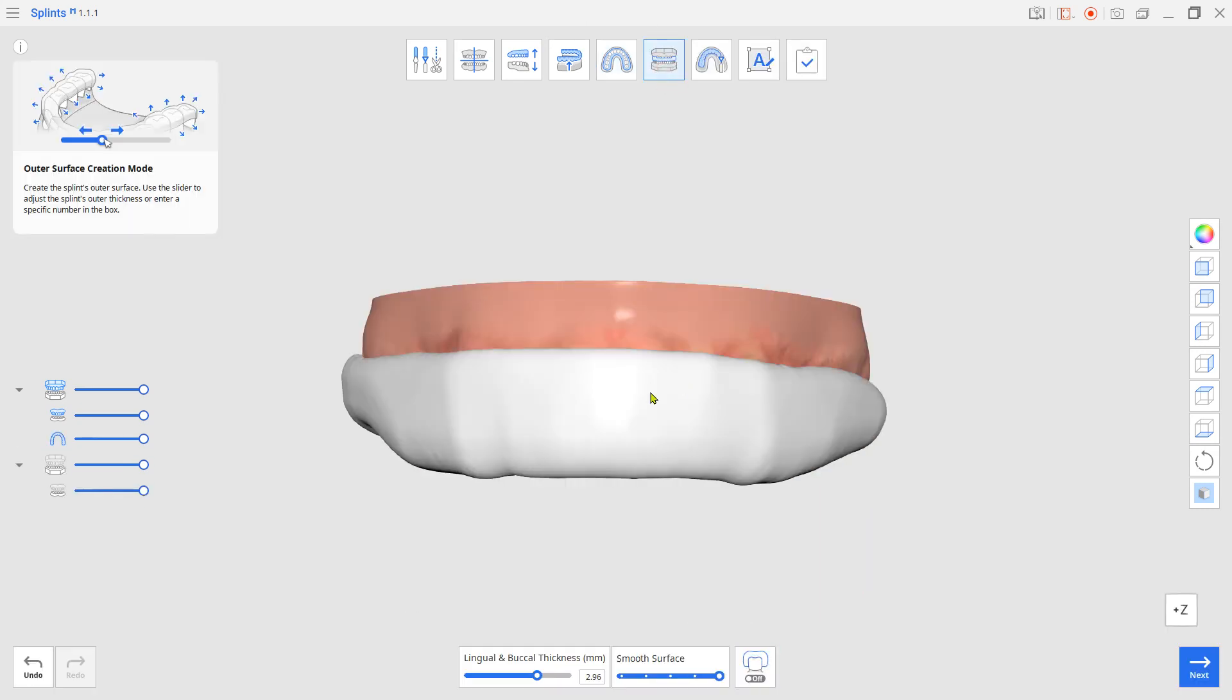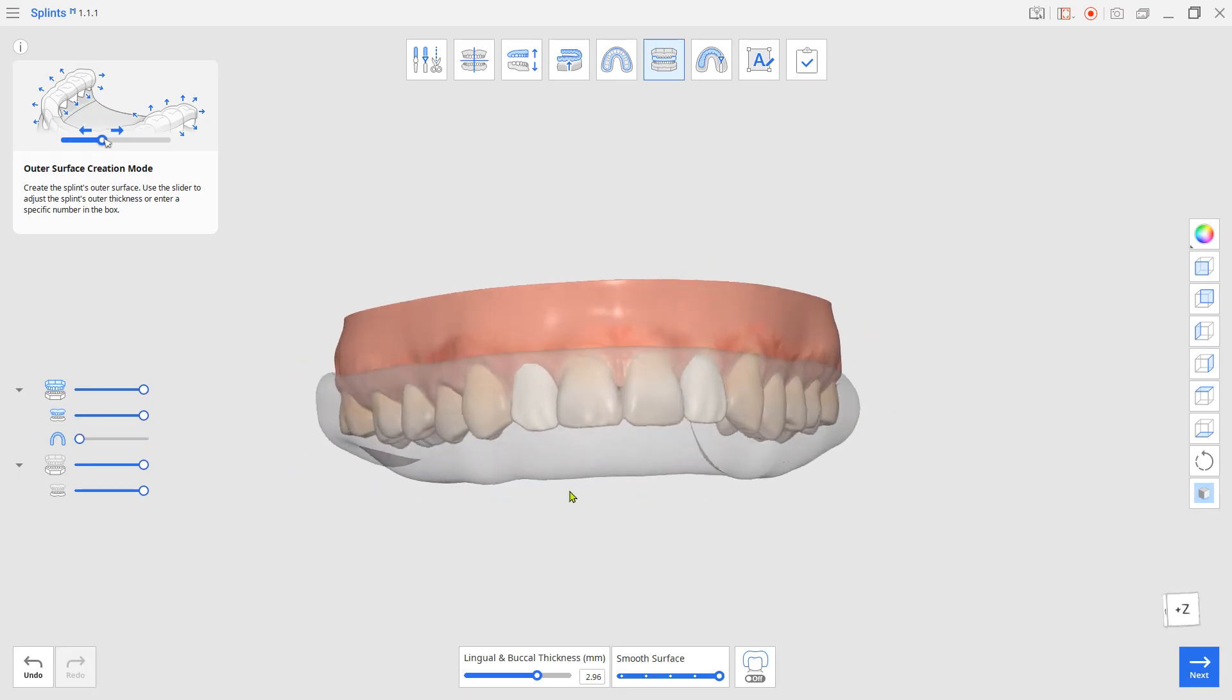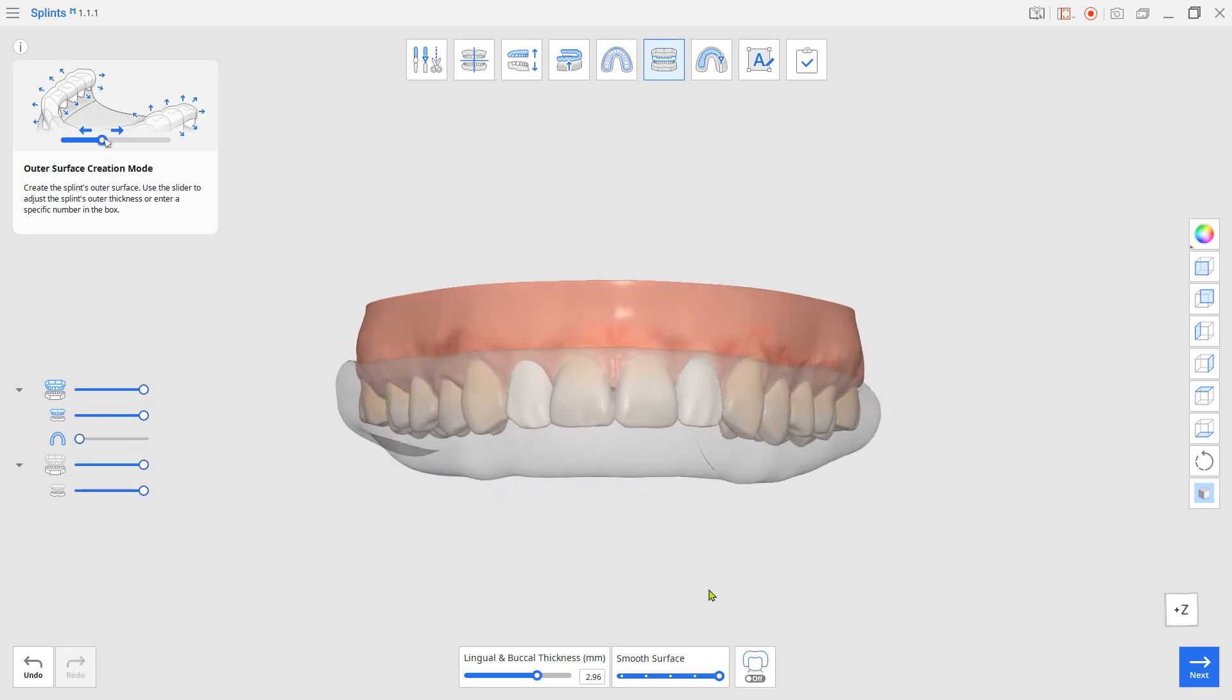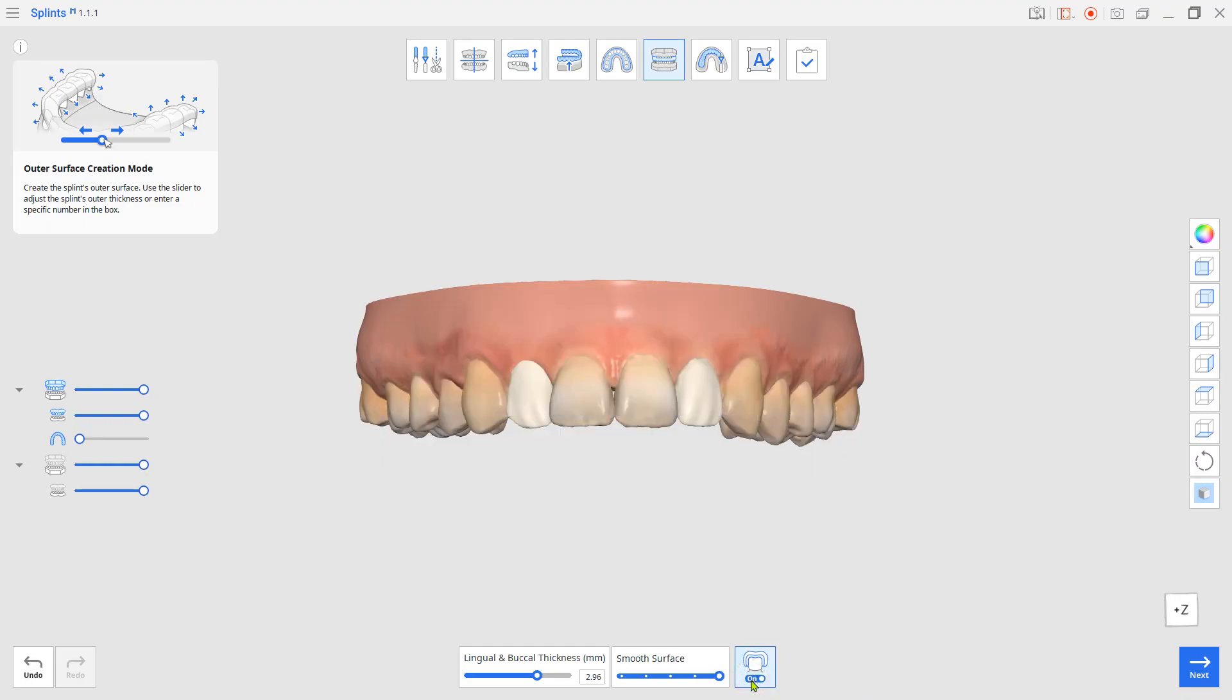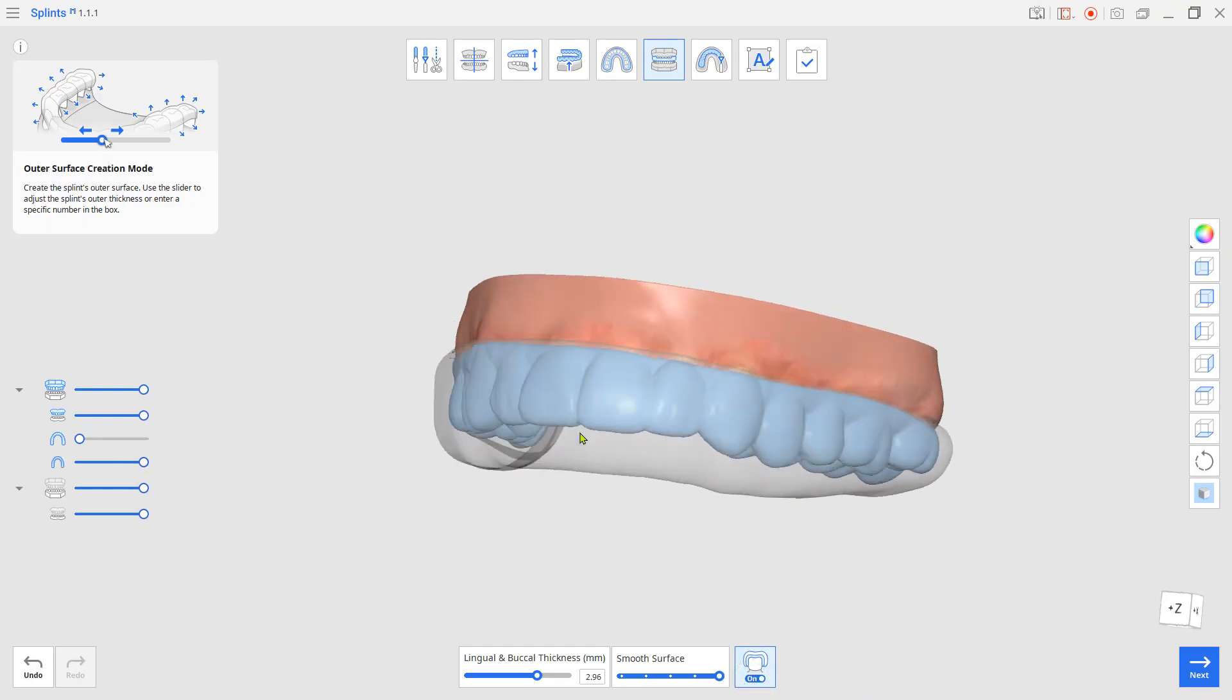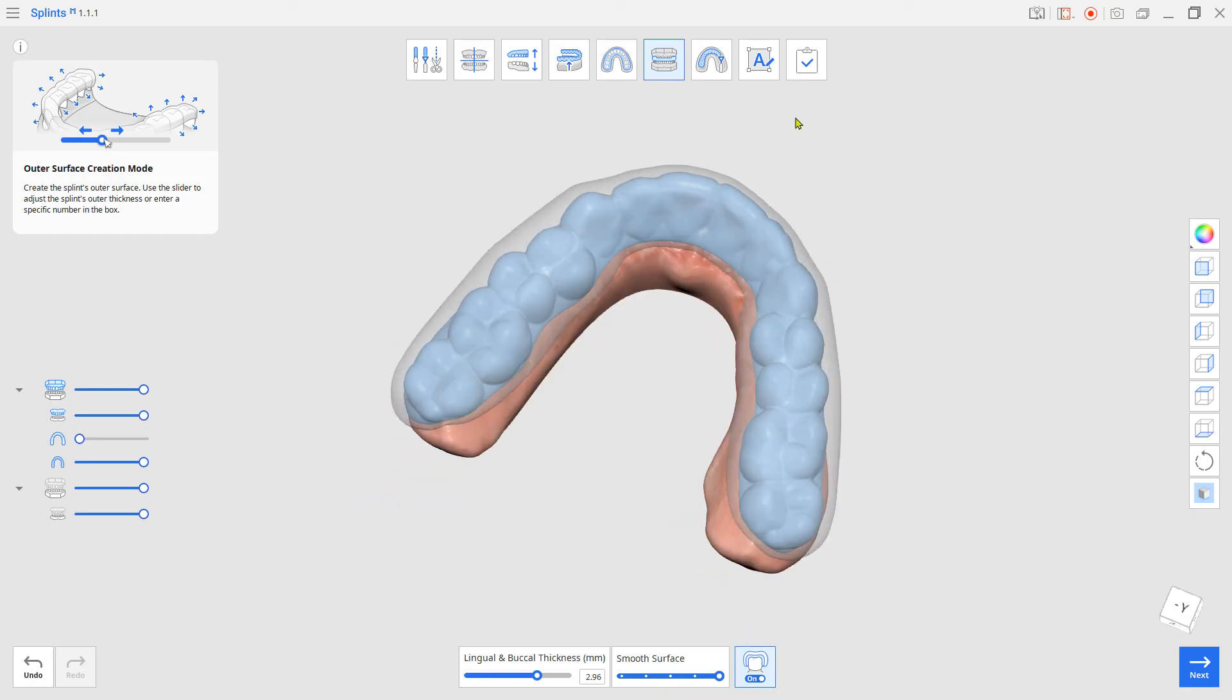In outer surface creation mode, turn the dual layer option on from the bottom. Click complete to save.